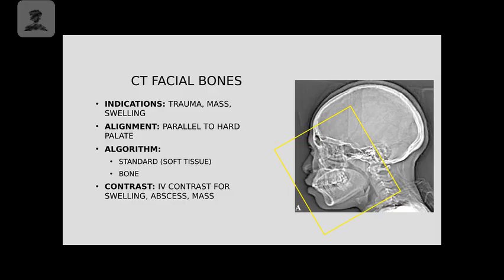So we're able to see it more like the patient is standing up in the air. One thing about that though is it can be very, very difficult to get the patient to extend their chin that far. So a lot of times we still end up imaging them with their back on the table. And it's okay, it's just not going to give us the best air fluid levels.